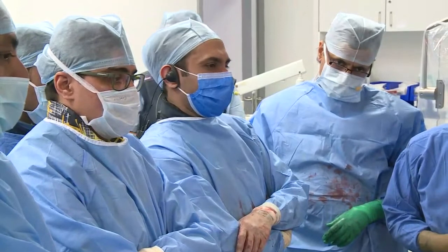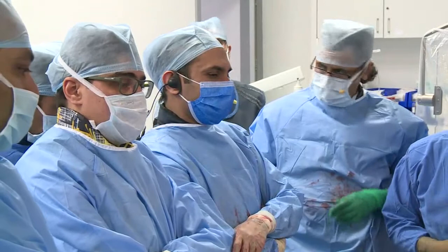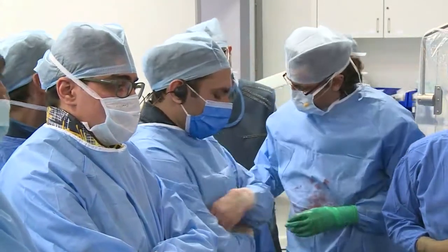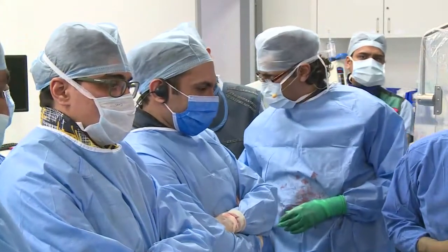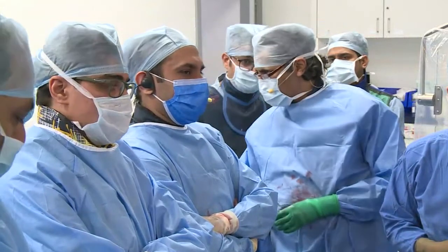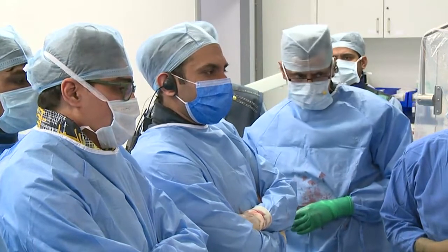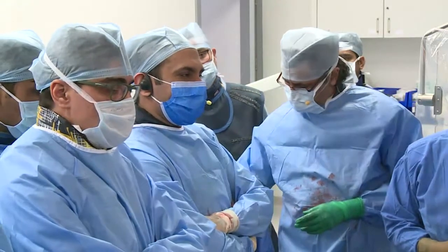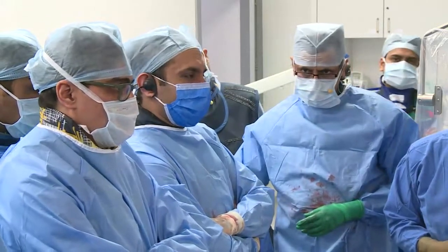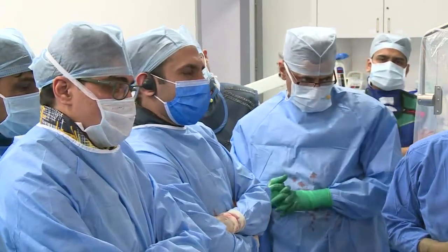So we deflate it. And you have good experience, because the other company who sells the balloon inflatable valves suggests using a regular temporary pacemaker wire for more stability. Yes, I agree completely with you. We do all our procedures with the balloon tip wire because it's much safer. I have never seen a ventricular perforation with a balloon tip wire. I totally agree with you.